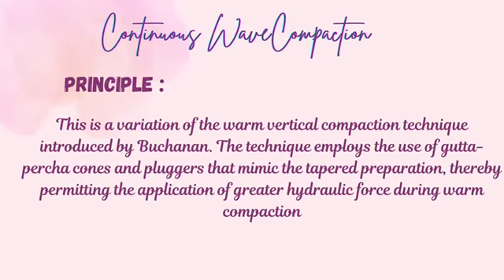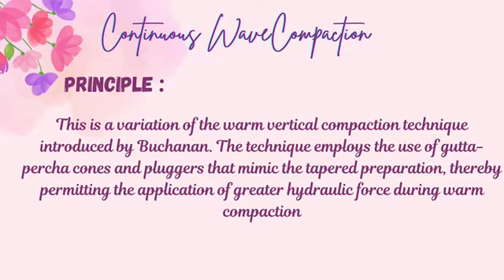Continuous wave compaction. This technique is a variation of the warm vertical compaction technique, and employs the use of gutta percha cones and pluggers that mimic a tapered preparation, thereby permitting the application of greater hydraulic force during warm compaction.